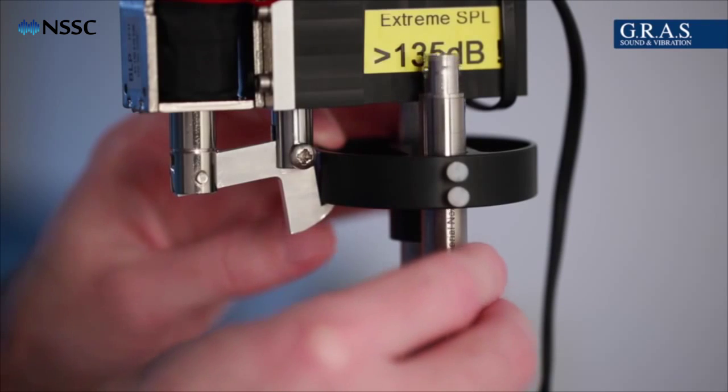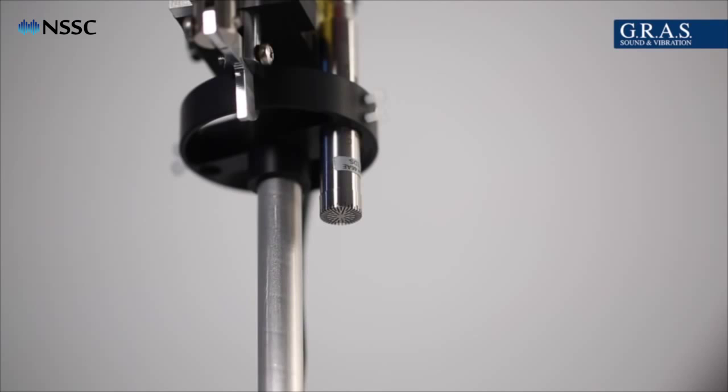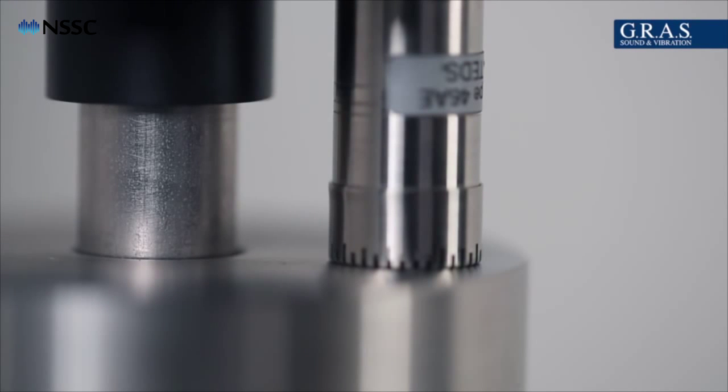The drop test simulates situations where the microphone by mistake is dropped onto the ground. Mounted in a fixture, the microphone is dropped from a height of 1 meter right onto a steel surface.